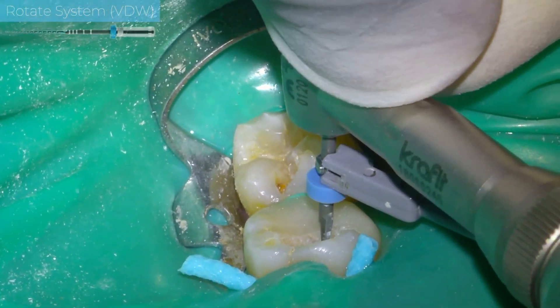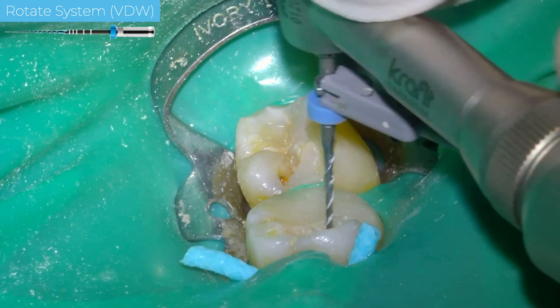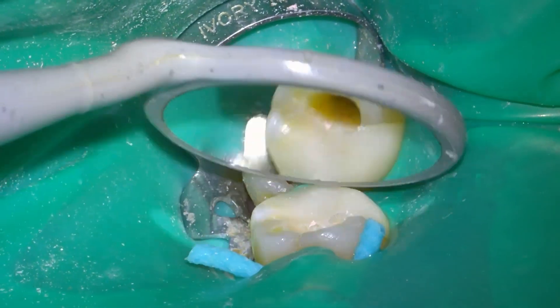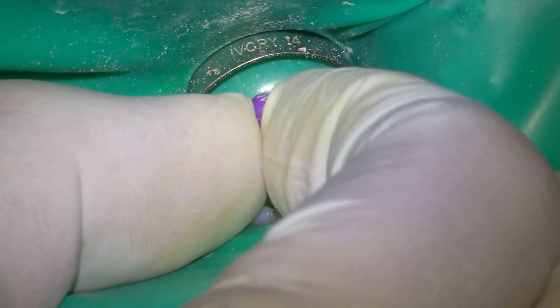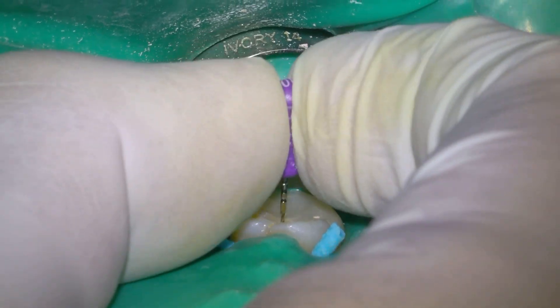I attach the apex locator to the rotary files when I am working the canal, to avoid over-instrumentation. In retreatments, I use this type of file every time — they are very resistant and move very well in the canal.